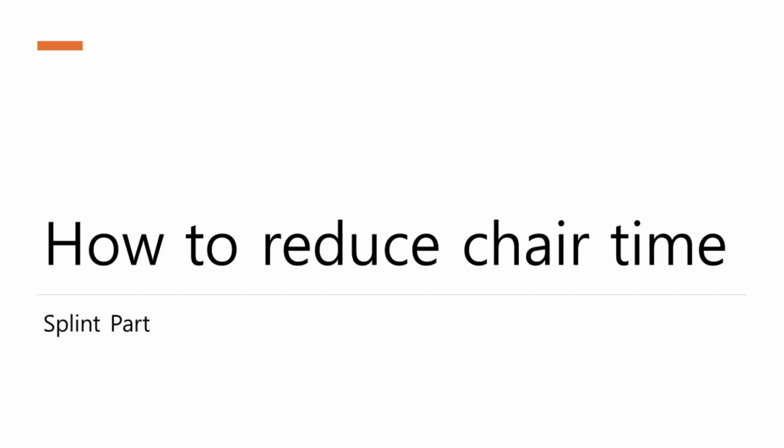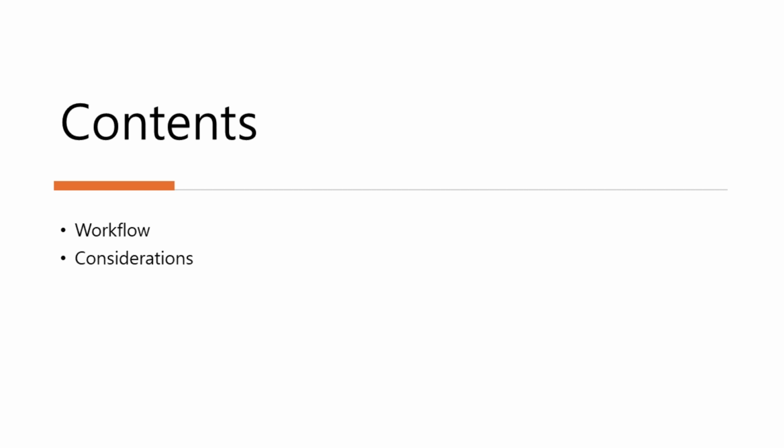In this lecture, we aim to introduce the overall workflow of creating splints digitally with a particular focus on checkpoints to reduce clinical time. This lecture is structured around 2 main themes: workflow and considerations, aimed at providing a comprehensive understanding of both the procedural flow and the critical evaluative process in our field. We begin by exploring the workflow. This section aims to outline the entire process from initial concept to final outcome.